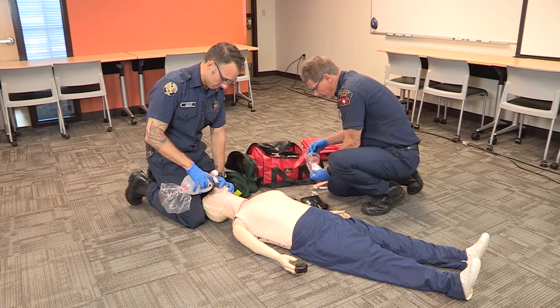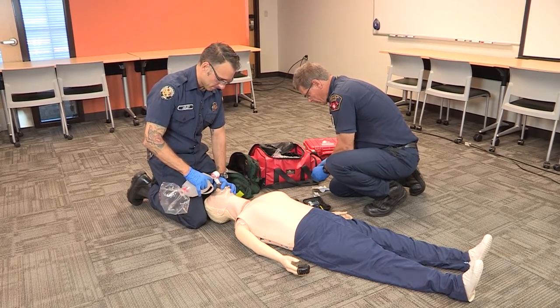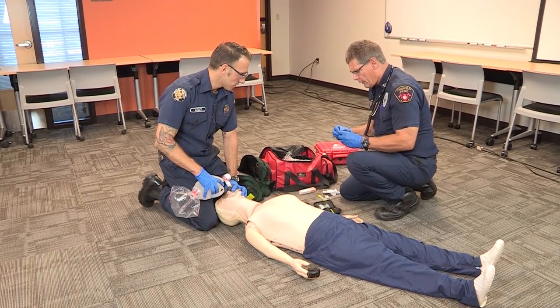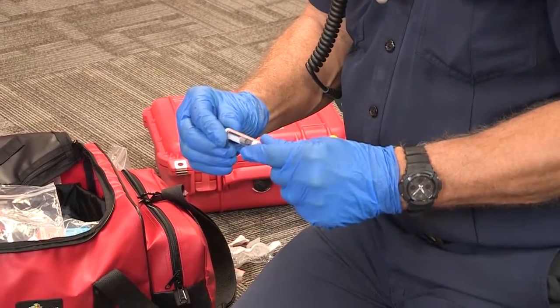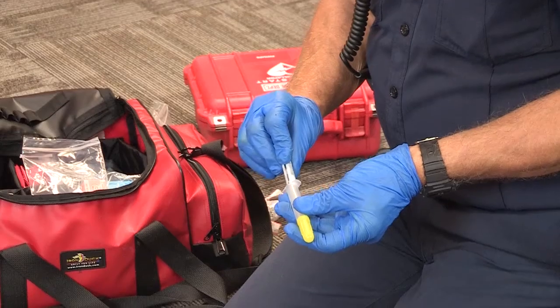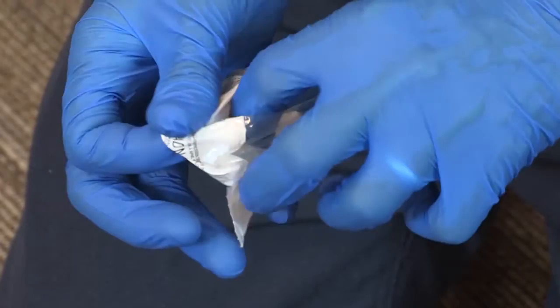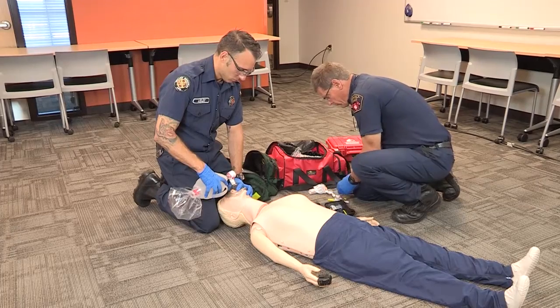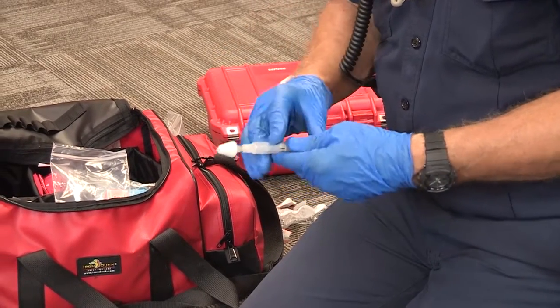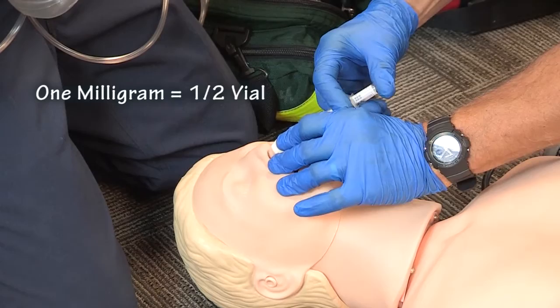Narcan kit is ready to go. I'm going to verify I have Narcan 2 milliliters — the medication is clear and the expiration date is 5 of 18. I'm going to go ahead and screw in the syringe and open up the MAD device and screw that on. Reed, after your next ventilation, I'm going to go ahead and give one milliliter of Narcan.